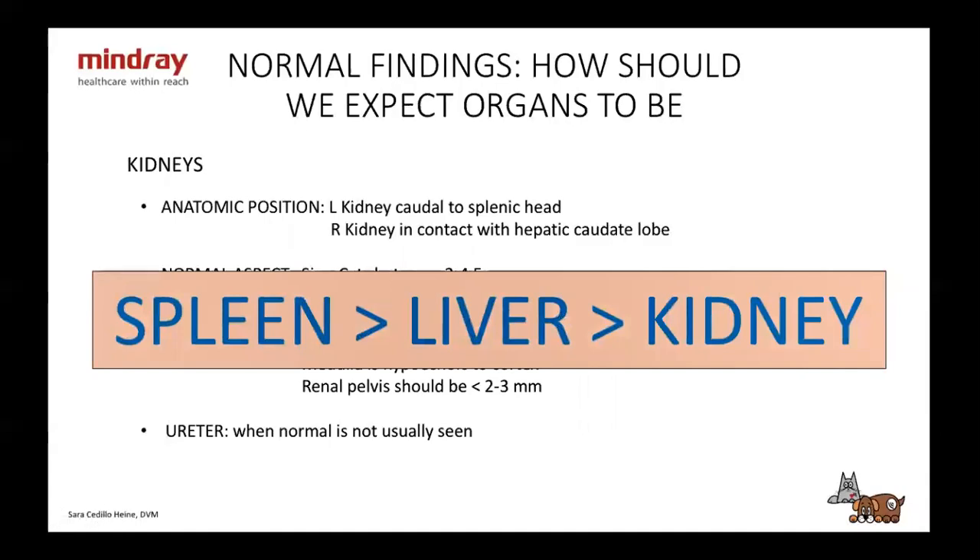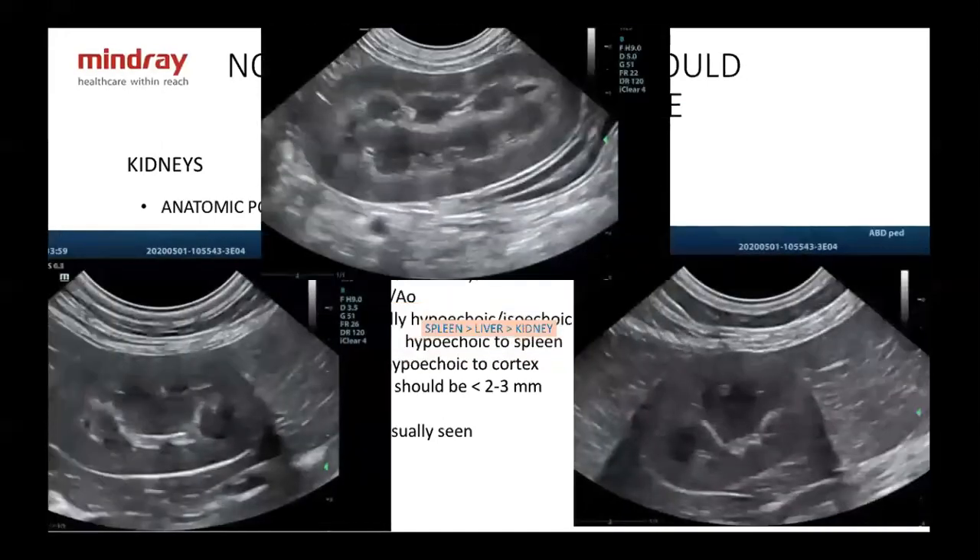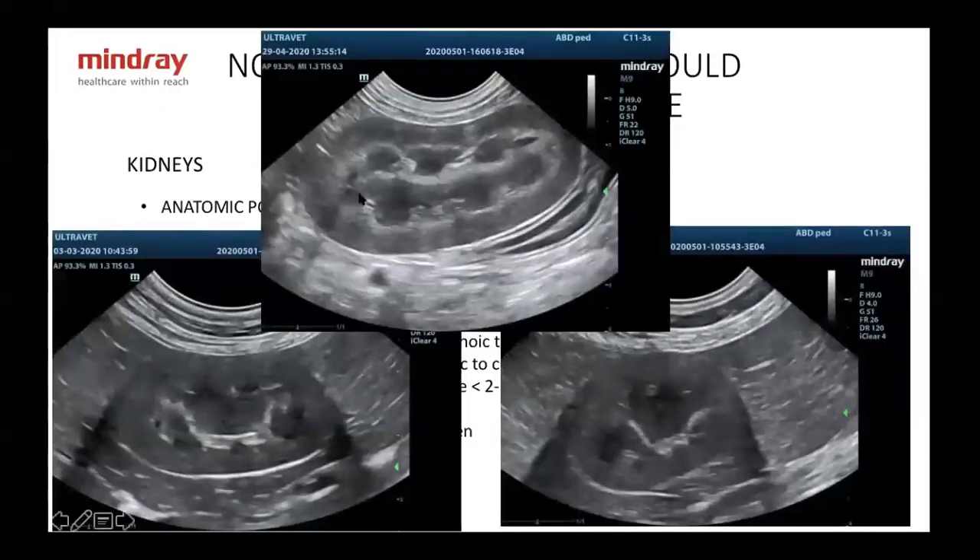Echogenicity reference points to remember: the spleen is most hyperechoic, then the liver, and then the kidney — hypoechoic or isoechoic to the liver. This is very helpful when in doubt: if a kidney is hypoechoic, you can compare it to the spleen to confirm. Here are normal kidneys — a large Greek dog, a medium-sized dog, and a cat. You can see the medulla is hypoechoic to the cortex, and the cortex is fairly hypoechoic compared to a normal spleen or liver.